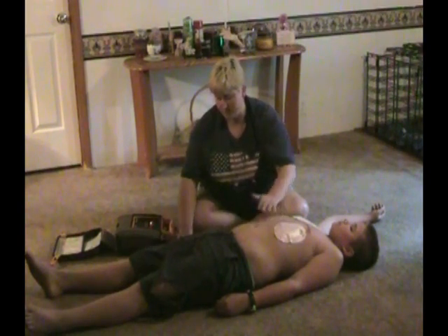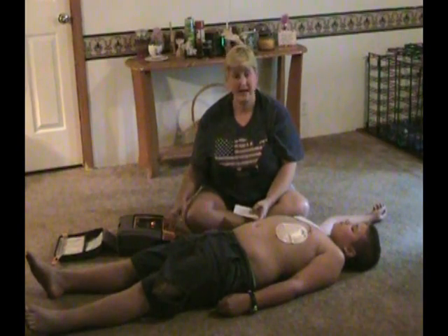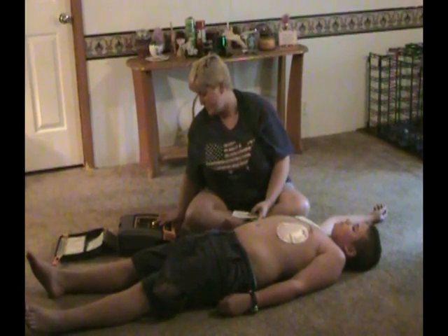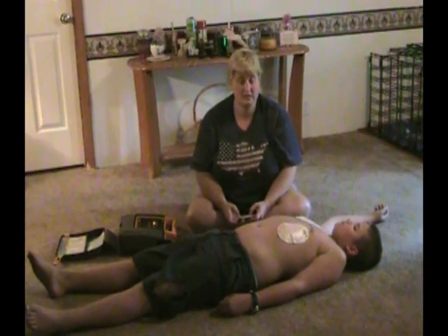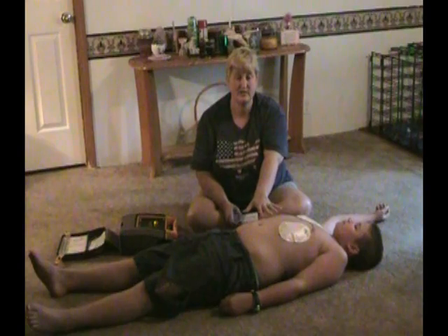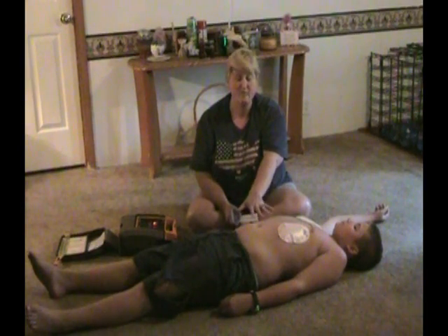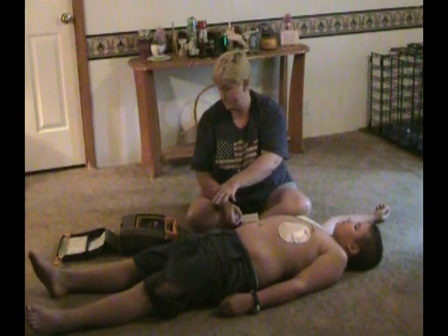Now that we have our pads in place, we're ready for the machine to analyze the heart rhythm. We'll push the analyze button and wait for it to complete. You want to make sure nobody's touching the victim. Any movement can cause the machine to pick up a heart rhythm that's not there.